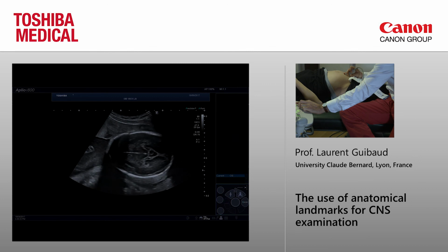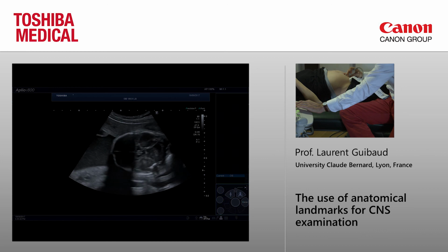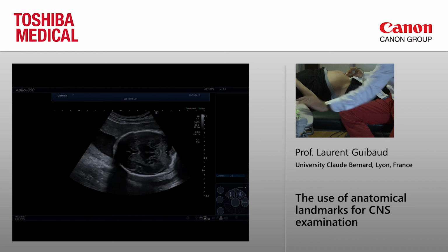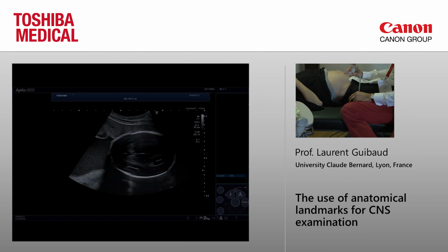And you see how clearly you see the aqueduct, the lumen of the aqueduct here. In fact, we can do that in an orthogonal view to show you the aqueduct. It goes from the third ventricle, and here you have the lumen of the aqueduct.